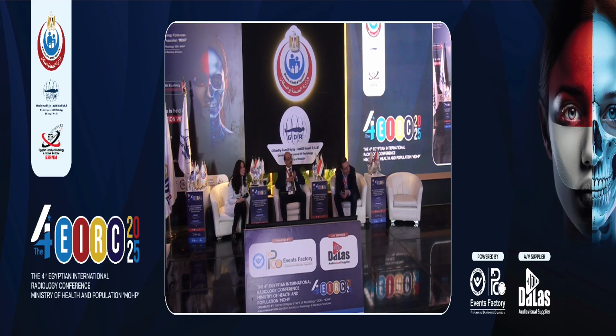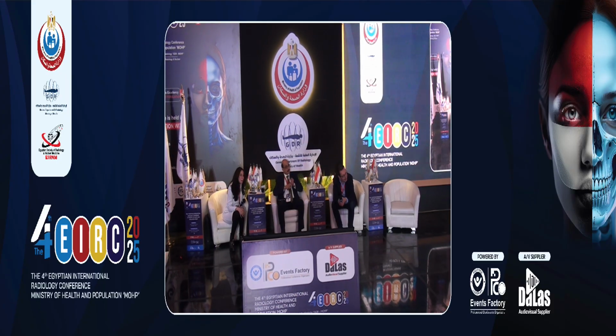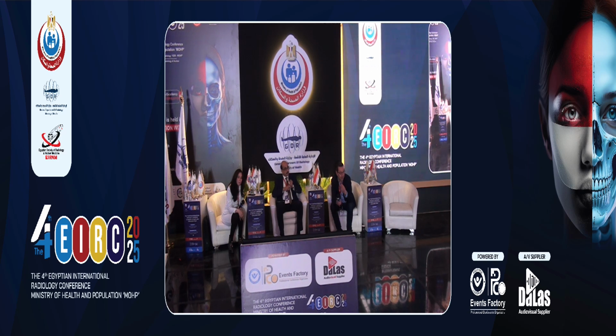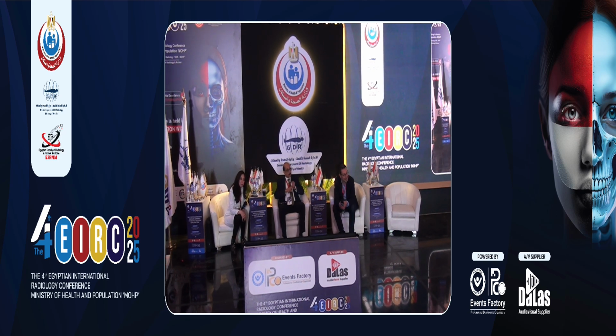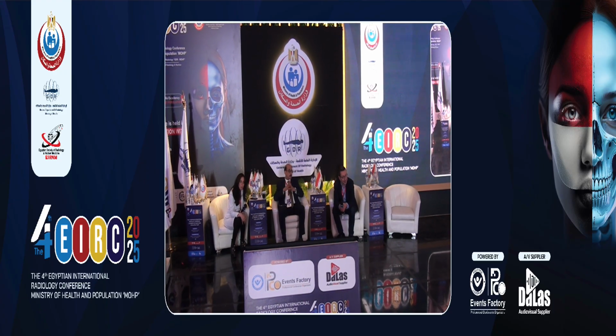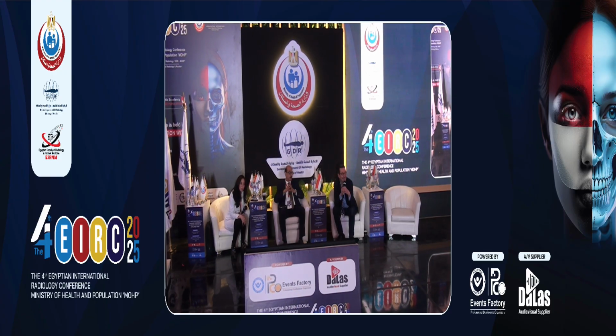I totally appreciate and understand the debate, but actually provocative angiography saves a lot of time if you are using glue, because the glue is ready. I'm not quite sure whether this or this is bleeding. We do provocation, it bleeds at once, and we inject it. I know Hisham doesn't like this, and I've shown him a case that was over-provoked.